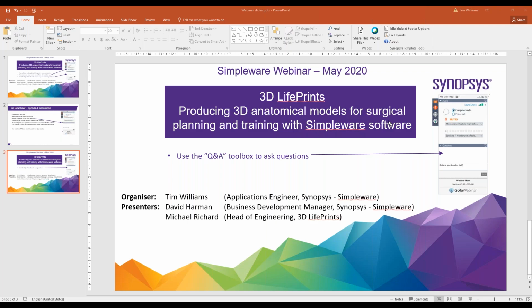That's a great question. At the minute, 3D printing is so advanced, especially the multi-material polyjet printers that we used for both of these models, that the printers are often laying down between 16 and 32 micron layers of detail. What we have always found to date is that, with the scanning technology, you would only ever clinically get a CT that maybe has 500 micron slices.